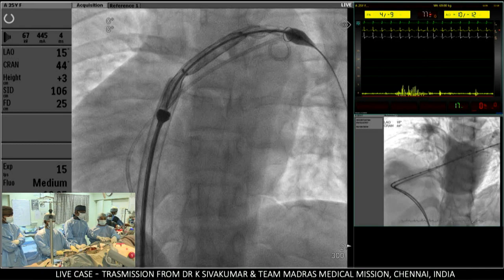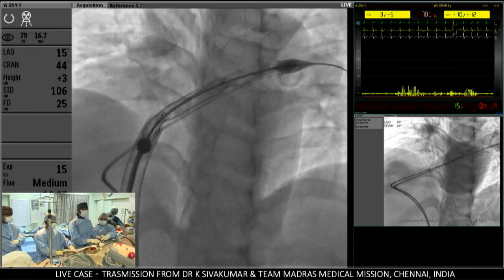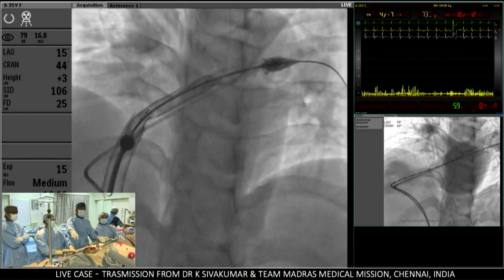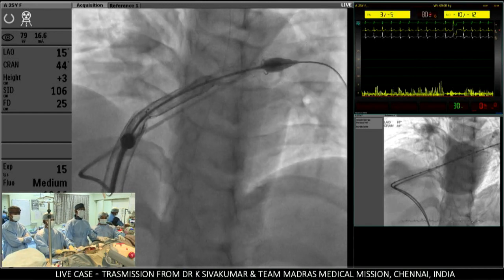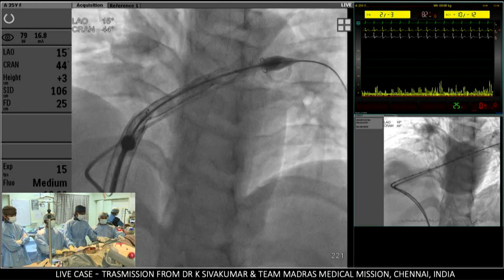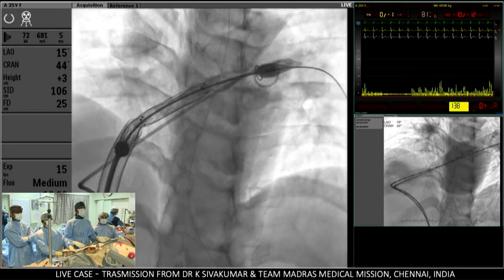Siva, yes? Hi. Just a quick question, how often do you see such idiopathic dilatation of the pulmonary artery needing valve intervention? This is the first one, Eric, that we are doing, because the patient has a regurgitant fraction of about 66. No, I understand it, but it really seems unusual. Yeah, I've got Warwick and CC here who've probably put in a lot of P valves. Let's get some comments from them.